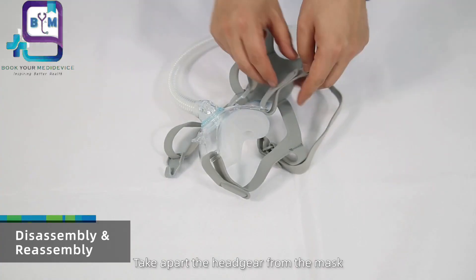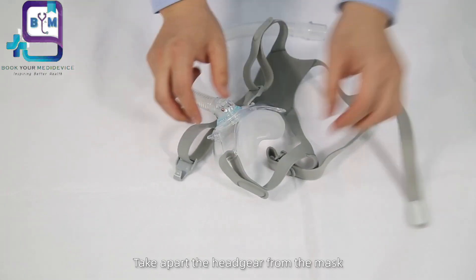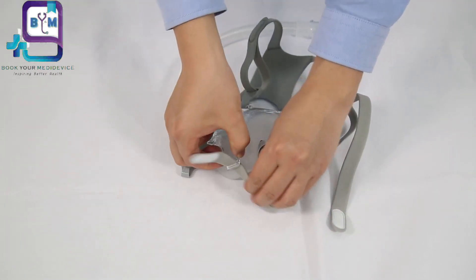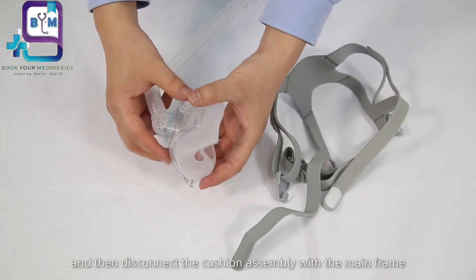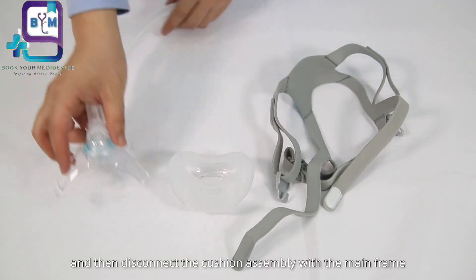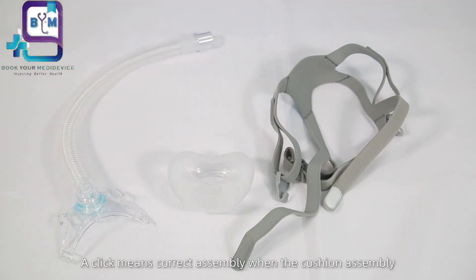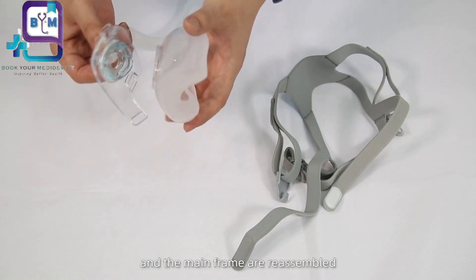Take apart the headgear from the mask, and then disconnect the cushion assembly from the mainframe. A click means correct assembly when the cushion assembly and the mainframe are reassembled.